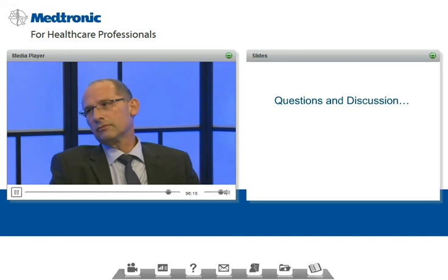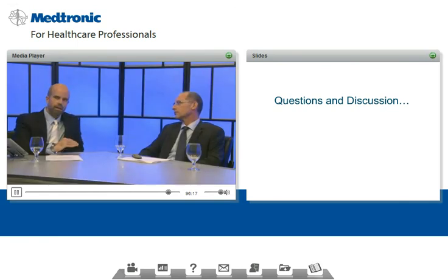Makes sense. And actually, while we're on the topic of hypoglycemia, as we look at tightening patients' control as much as we and they can, some hypoglycemia is going to be impossible to avoid. So could I get both of your perspectives? If you have a patient come in who is working to titrate their doses to get their control better, what would be an acceptable amount of hypoglycemia? I think where this is coming from is that we might see some educators and healthcare practitioners focus so much on the lows that we end up sending patients a little higher and therefore may erode their A1C a little bit. So I hope that question makes sense.